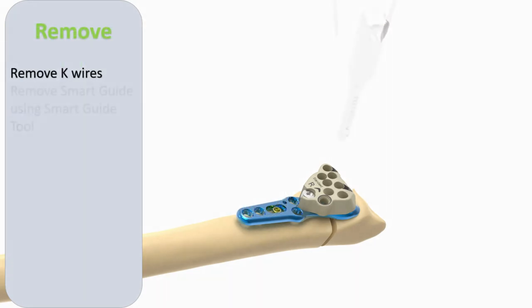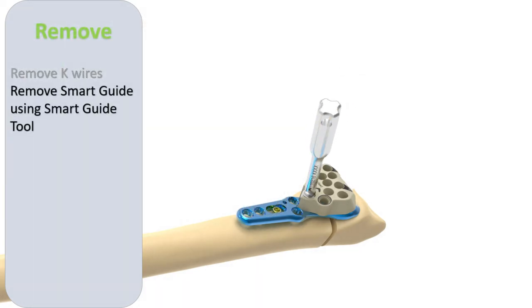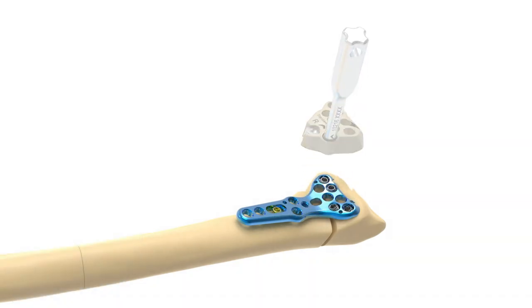The K wires and smart guide are then removed, and the remaining screw positions are subsequently drilled and filled.